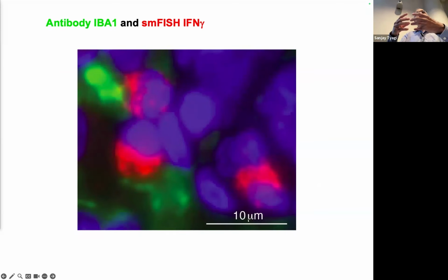for safety of these experiments, you fix the tissue in BSL-3 in a high concentration of formaldehyde for weeks. And for the sake of convenience, you keep it for months and years in that tissue fixative. And so the tissue is highly cross-linked and messed up. And so in this, you can't see those fine grains, fine spots.